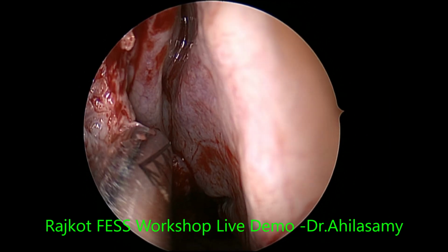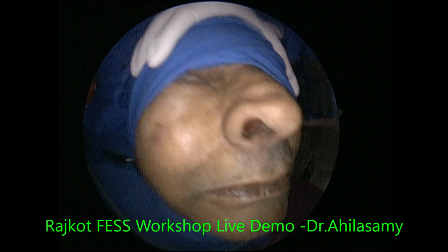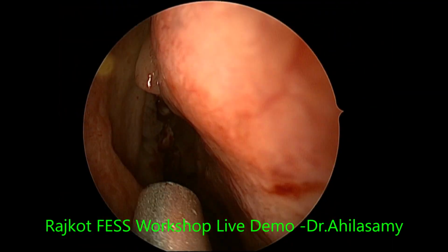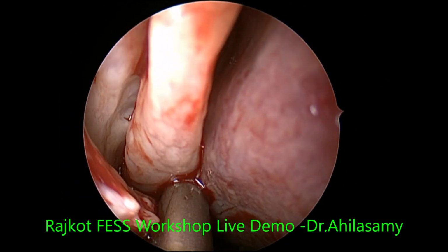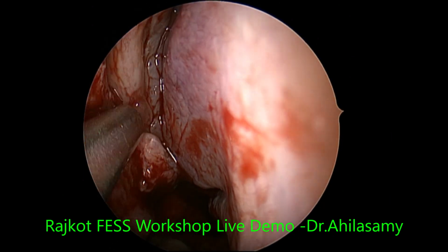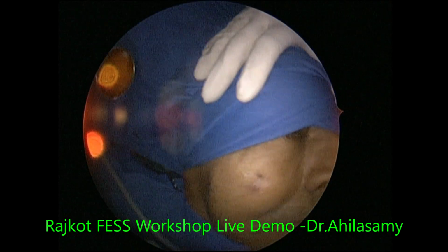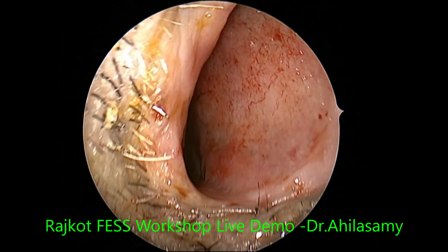Sometimes I may trim the lower half of the superior turbinate also, but I will try to preserve it because that has a lot of olfactory fibers. See, this is your superior turbinate. That sphenoethmoidal recess is a little polypoidal, and there is a little discharge also. That area also needs to be trimmed with the shaver.